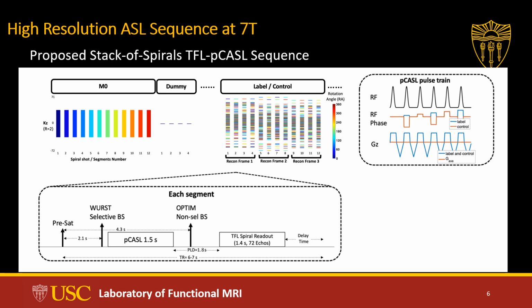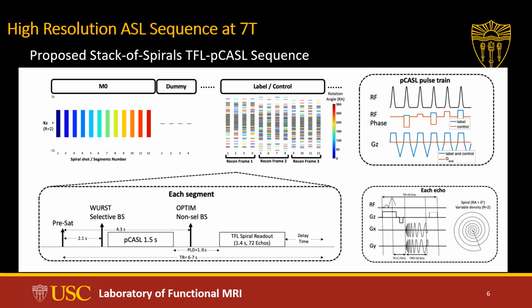We also used a 2 minute pre-scan to get a global frequency shift around the labeled arteries and applied it as a linear ramped phase in our labeling. In each echo, there is an RF spoiled gradient echo with an asymmetric RF and a spiral gradient.